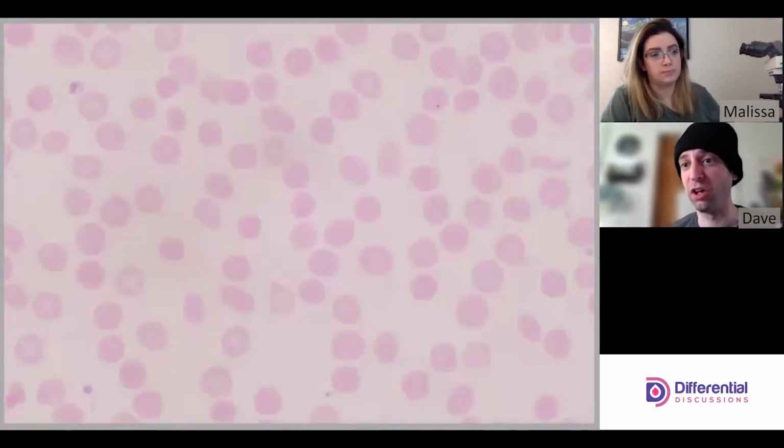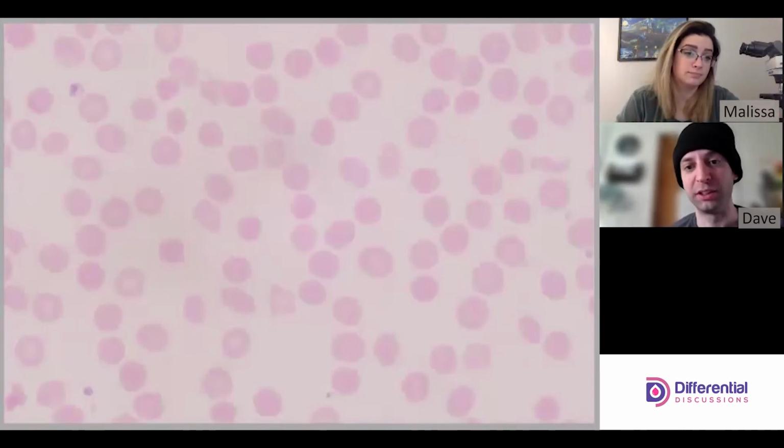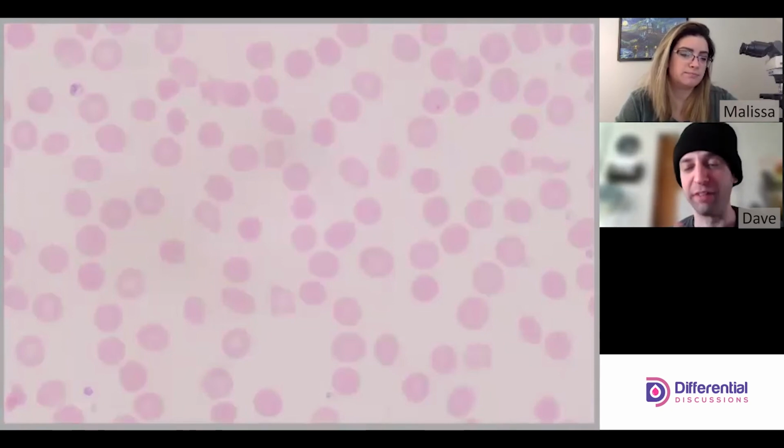There still could be a realm of possibility where the draw was poor, but that can't be determined by us on the bench with the slide. Right. That would be caught at the analyzer perhaps, or across departments, right? Where we might have a contaminated draw, I think it would either be across departments or the physicians would note it as an anomaly. Right, right, right.